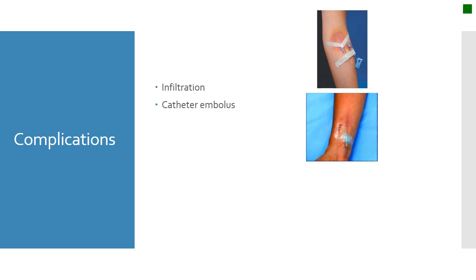Therefore, a clot forms in your catheter tip, and when you go to flush it later than you were supposed to, now you flush a clot into their system. Small clots can be fine, they can dissolve them, but if it is difficult to flush, never power flush it, because that clot may be too large.